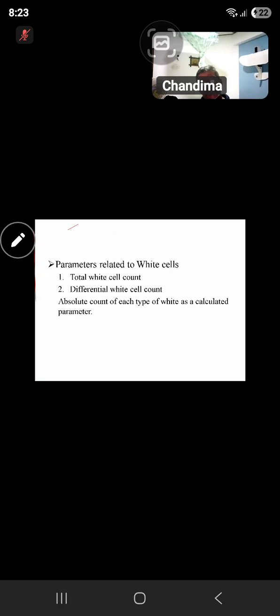Not only that, the immature granulocytes are going to be measured in these automated analyzers, and they are also going to count the NRBC. Even NRBC are going to be differentiated by the automated analyzer, right? If they calculate and give the NRBC, we can correct the WBC count using that NRBC percentage, right?